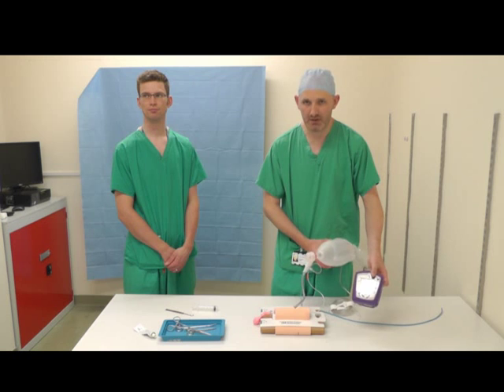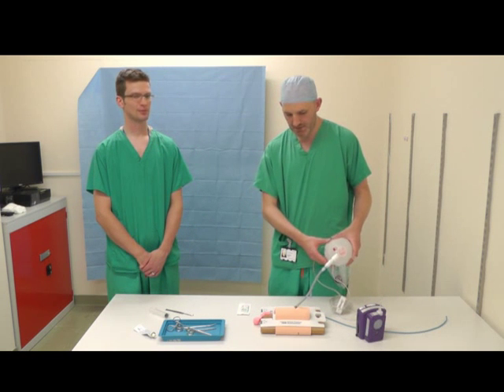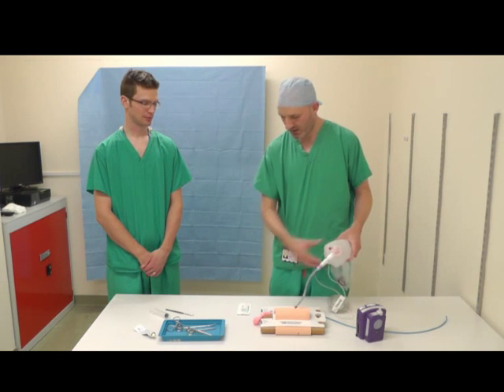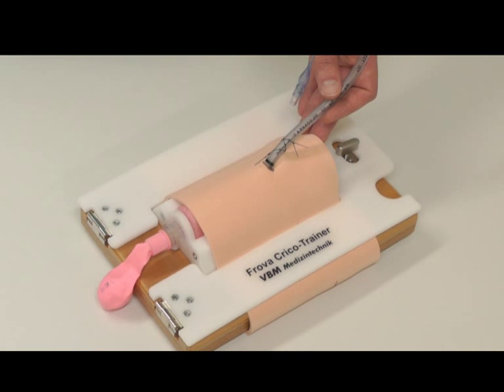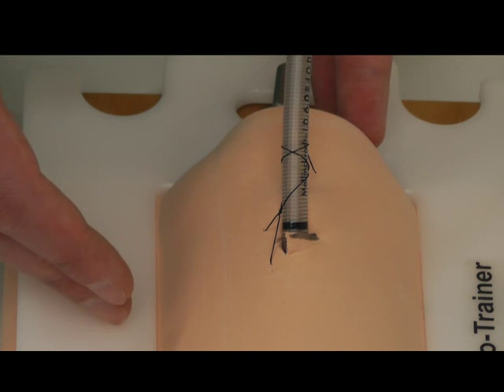and with a capnograph. Okay, so the tube's in place, we need to secure it, and we'll do that with a 2-0 silk suture. So here's the endotracheal tube sutured in place, just like you do with a chest drain with a 2-0 silk suture.